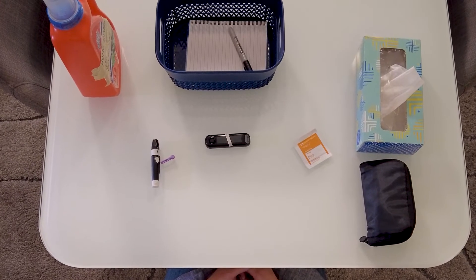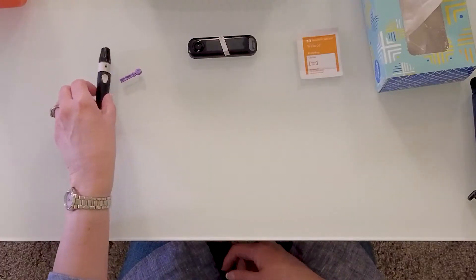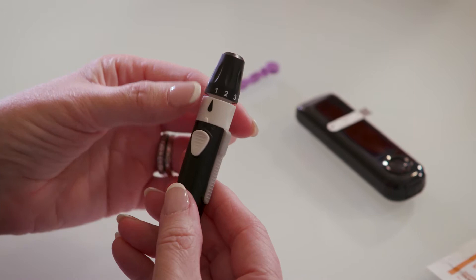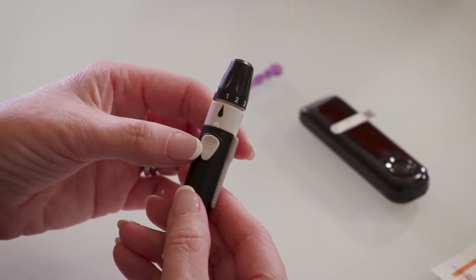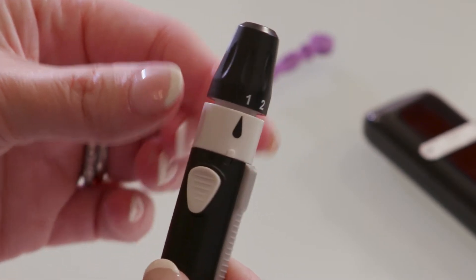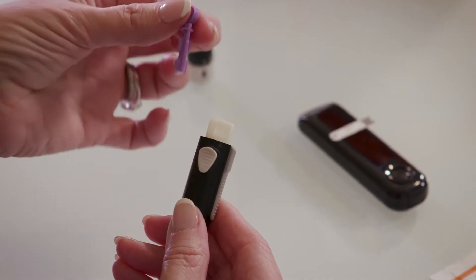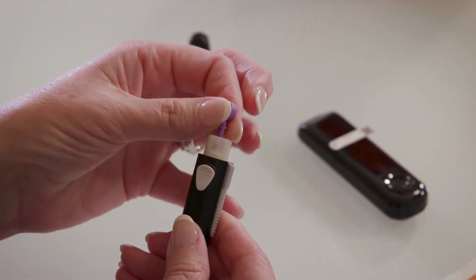Now that you have your supplies, you can get started with testing. First, get your lancing device ready. The lancing device's end cap is locked in place when the drop is lined up with the release button. Twist the white band to the right to unlock the end cap, then pull it straight off. Pick up the new lancet and, holding it by the round tab, firmly insert it into the center of the lancing device.